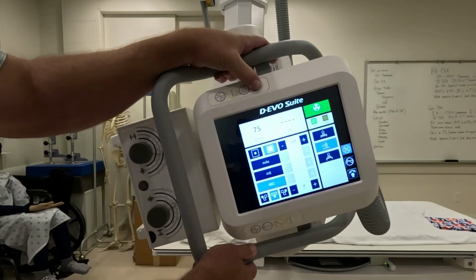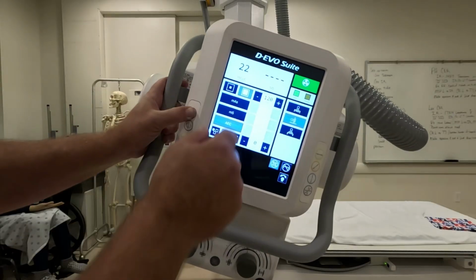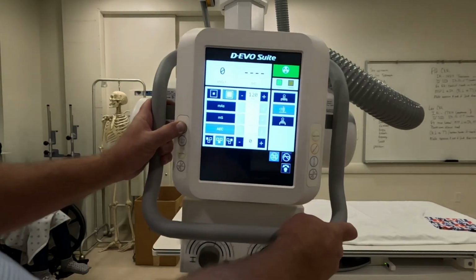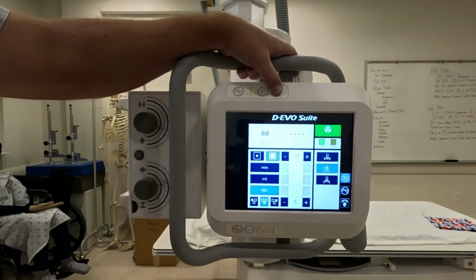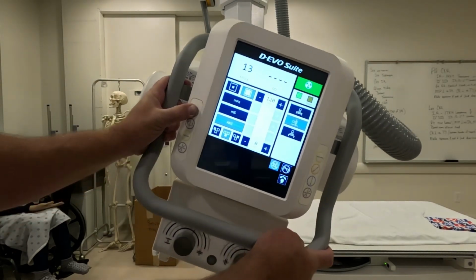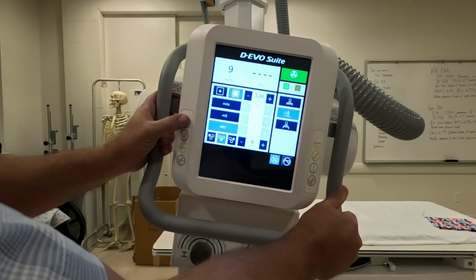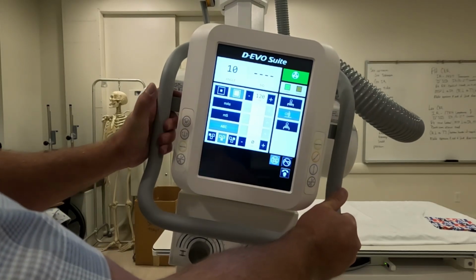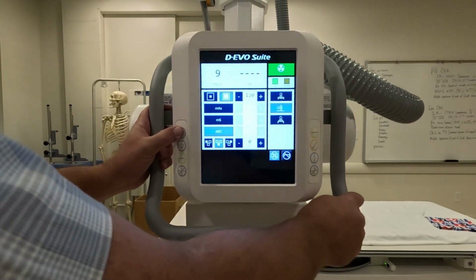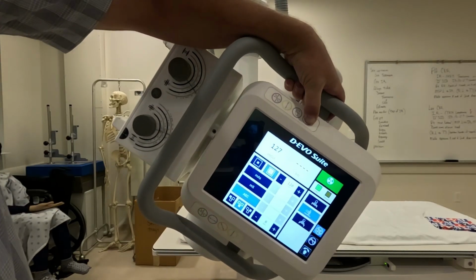But you've got an indicator, if you're needing to make an angulation that's not 90 degrees, right there that tells you how much of an angulation you have on your X-ray tube. So you have 0, it locks in at 90, and if you were doing something like a foot, it gets close to one of those two and gets a little grabby. But if you were shooting a foot, you might use a 10-degree angulation. So you can go anywhere from 0 to 90. You can even go past 90, in this case up to 125 degrees.